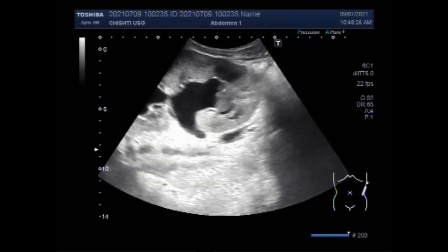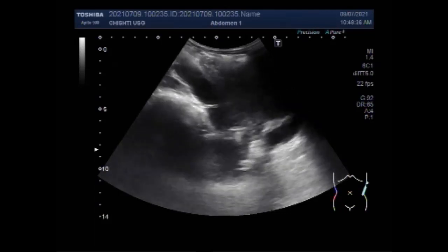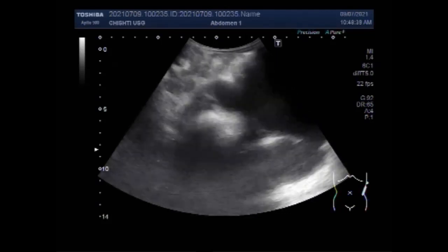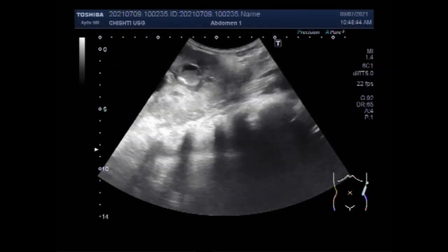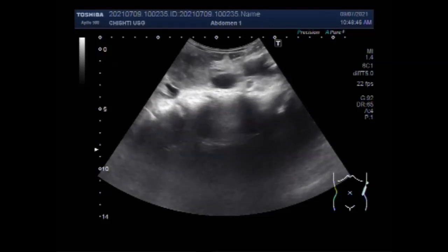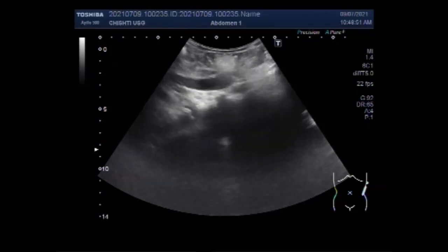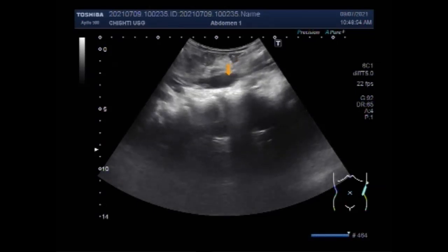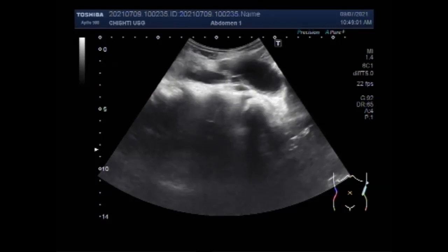Bladder diverticula occur as a result of focal herniation of the urothelium and submucosa, and usually occur in the setting of chronic elevation of intravesical pressure. Pelvic — that is bladder — ultrasound shows a large outpouching of the bladder wall and mucosa projecting from the lumen of the urinary bladder. You can see the tracing of the left ureter and no stone is seen.